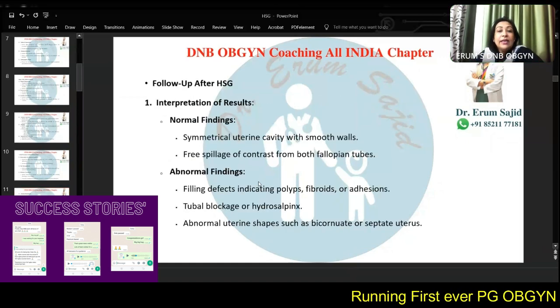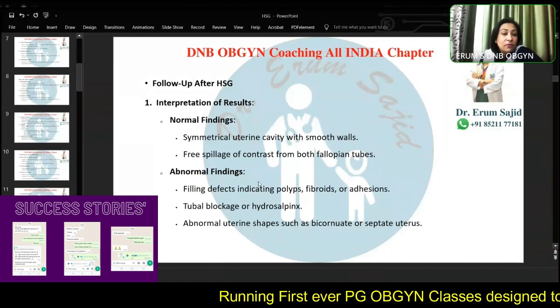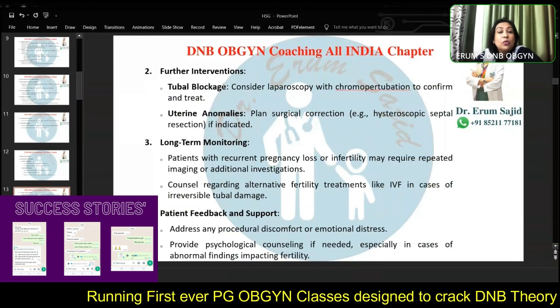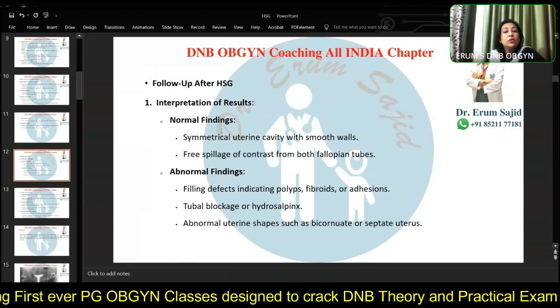All right. Now, how do you follow up? The interpretation of the result is whether it's a normal finding, whether it's an abnormal finding, okay? And you need a further investigation. See, how will you do that? You'll talk about the uterine cavity and you'll talk about the fallopian tube.